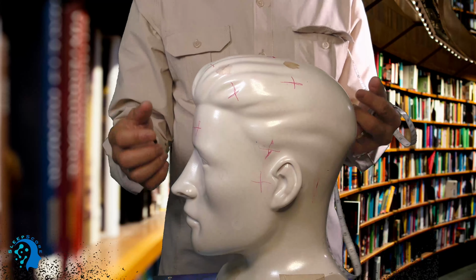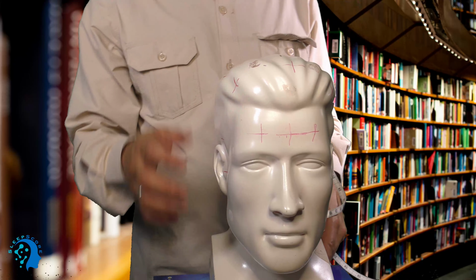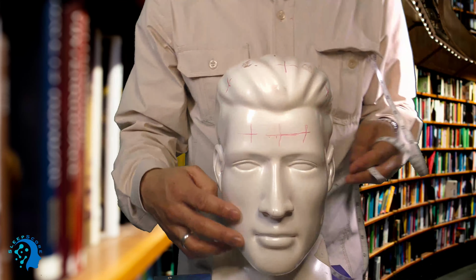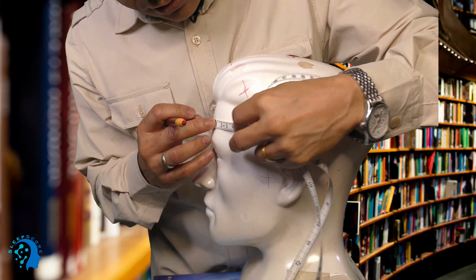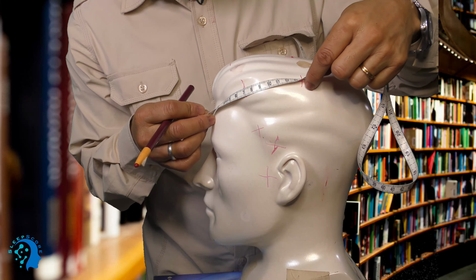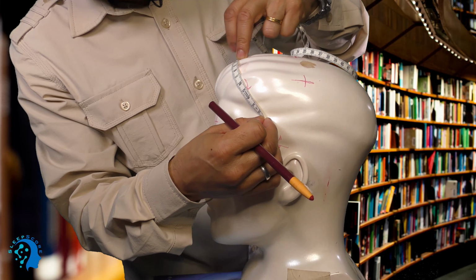Normally this is how we do it. But if you want to get the exact point, you have to go 10% from here too. I think that's the best way to do it. To find this F3 point, you have to go 10% here, which is about 5.6. First, take a half from here to here, which is 6.5, and then half from here to here, which is 5.5.